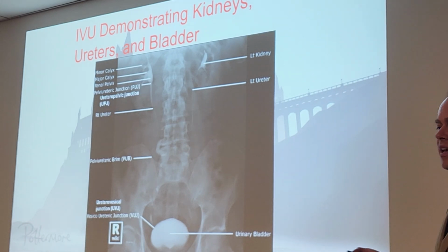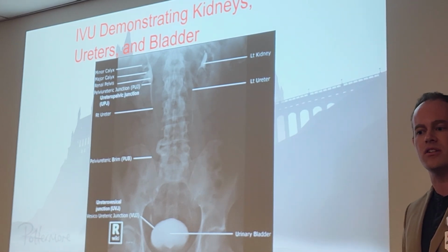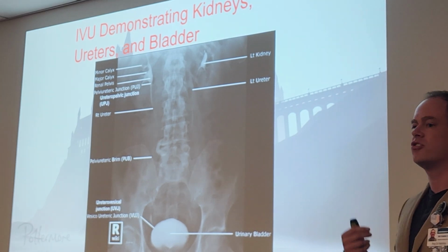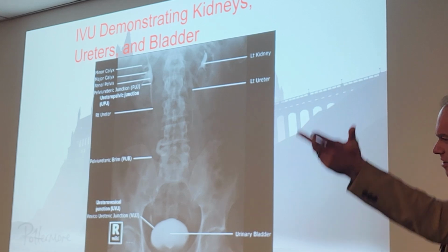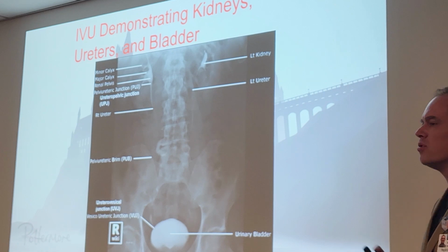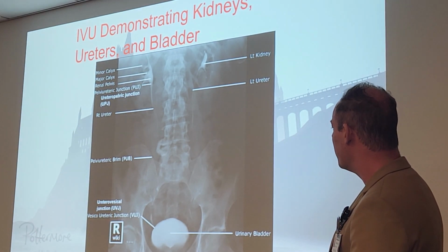Of course, the bladder, you can't miss it. You'll notice you can't see the inside structures of the bladder when contrast is introduced. We name things like the ureteral openings and the trigone. We can't see those unless we were actually looking at a model. Can y'all see that on ultrasound? The ultrasound can see inside that bladder a lot better than we can. We're just going to see the outside portion filled with contrast. So much easier to label on a radiograph.